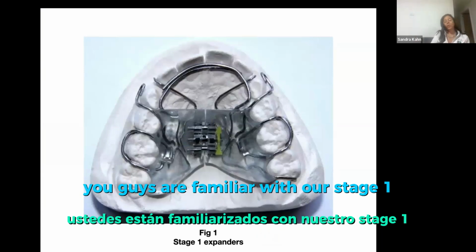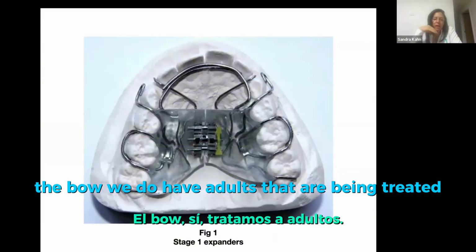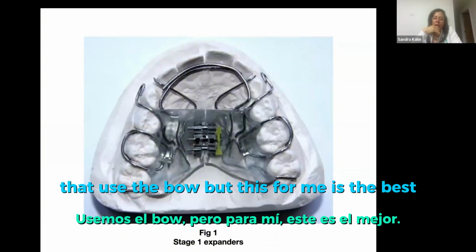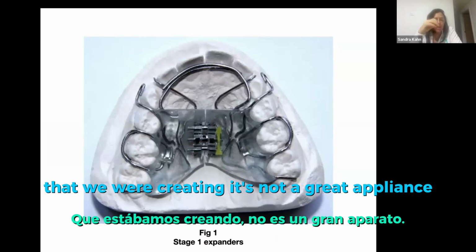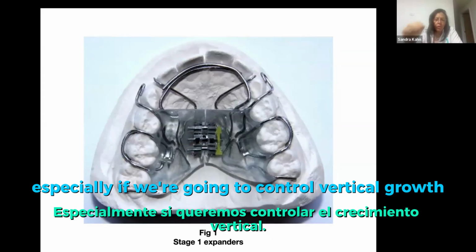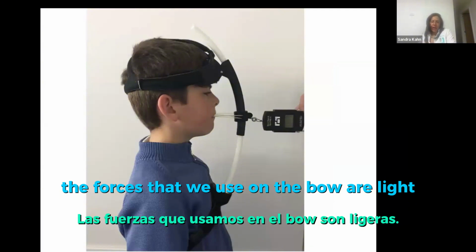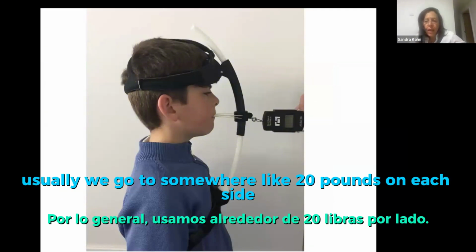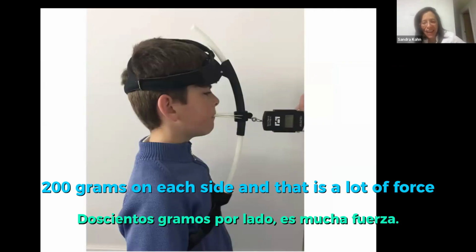You guys are familiar with our stage 1. I still feel this is the best appliance to work with the bow. We do have adults that are being treated that use the bow, but this for me is the best. This is an early appliance that we were creating. It's not a great appliance. It has some mistakes, and the shelves are critical, especially if we're going to control vertical growth on the bow. The forces that we use on the bow are light. Usually we go to somewhere like 20 pounds on each side. I'm sorry, 200 grams on each side.